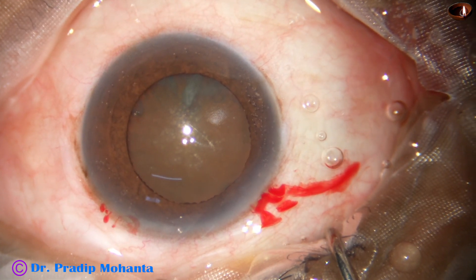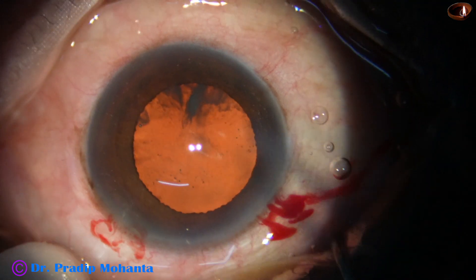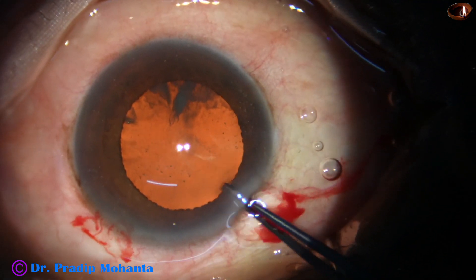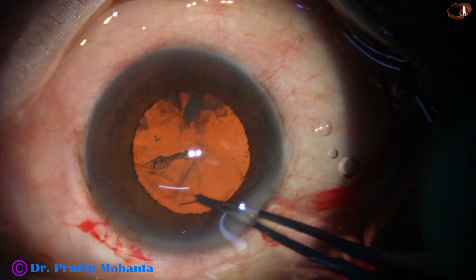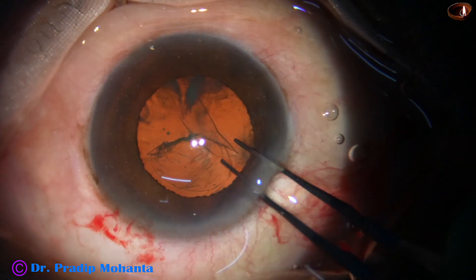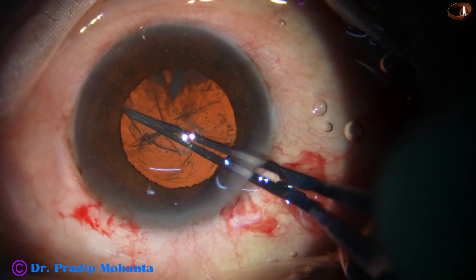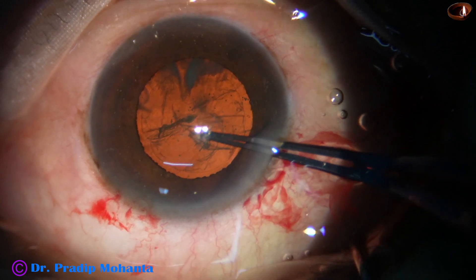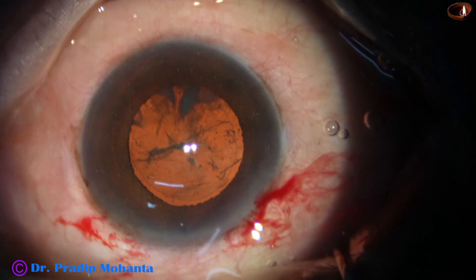This is a side port on the left side of the main incision. We can see mild bleeding at the incision sites, and this is good. Capsulorhexis is being done with the coaxial illumination of the Lumera-T microscope. The rhexis is done and it is adequate.